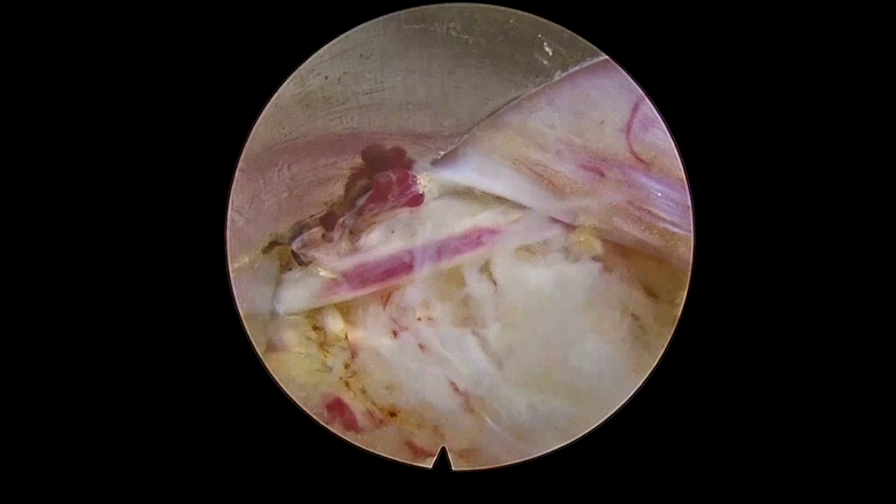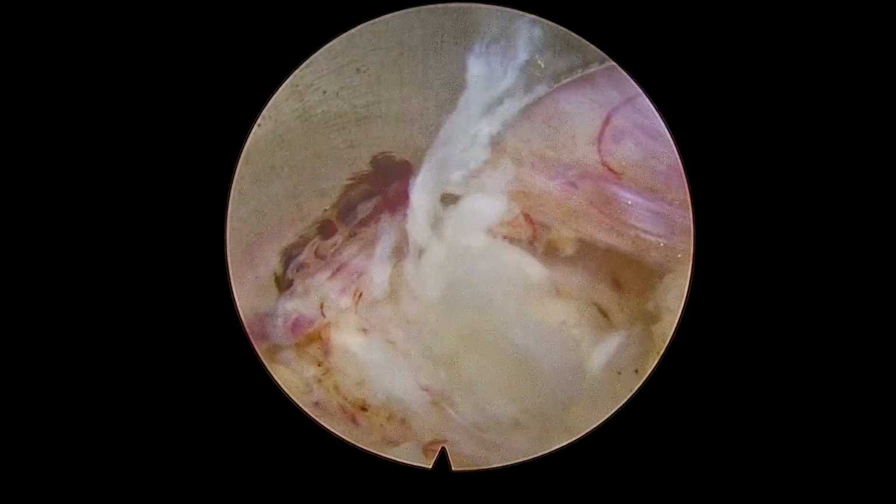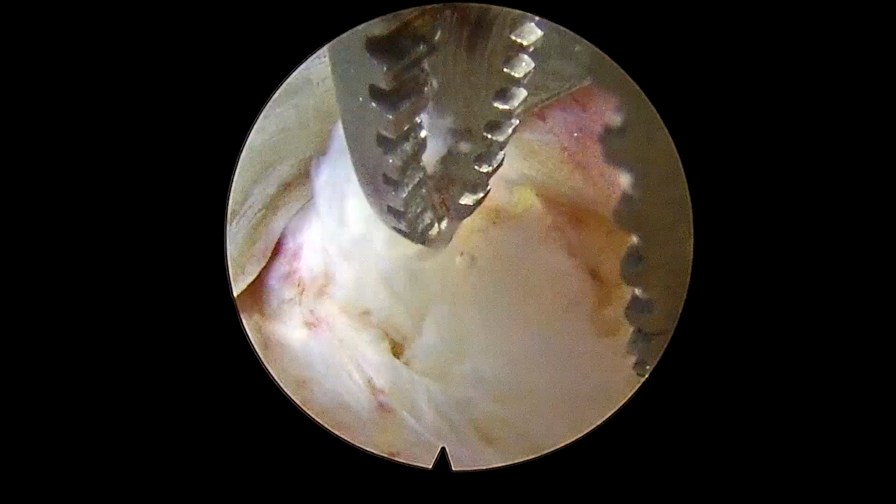So here what we are doing, we are now going inside. We will try to remove the free fragment from inside the disc space, and then we'll excise some part of the hardened annulus.